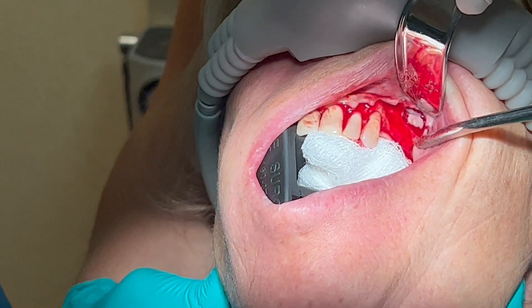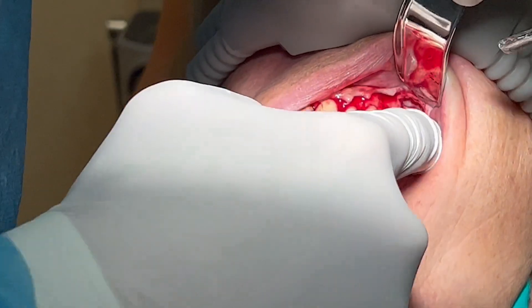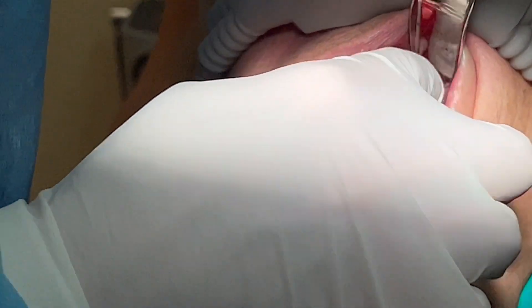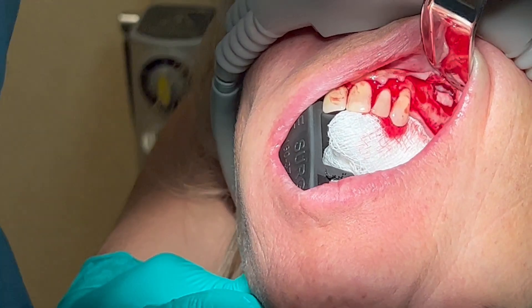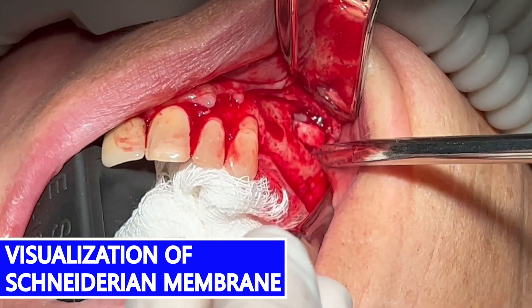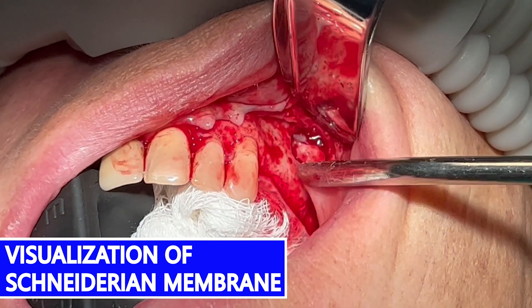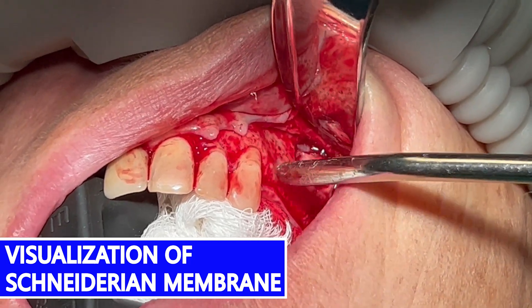Here's the start of my lateral window, and I can see the membrane is intact. I'm going to take a curette and perforate the sinus. If I was doing a sinus lift, the goal would be to maintain the integrity of the membrane. But since this implant is sitting in the middle of it, I have to violate it.